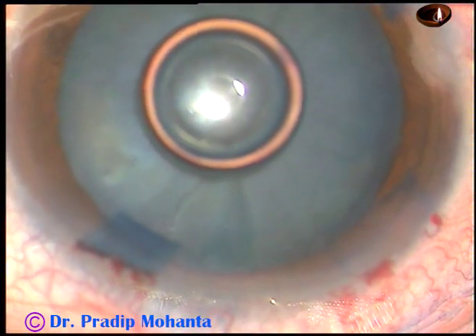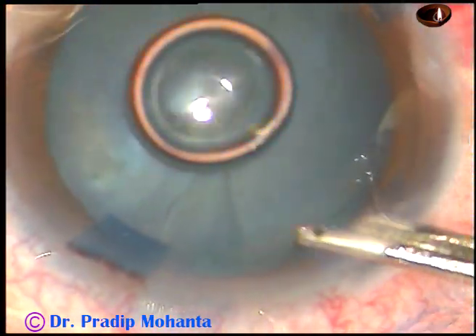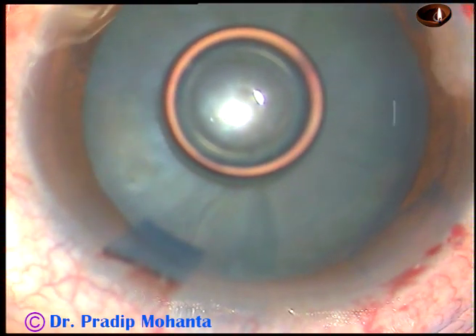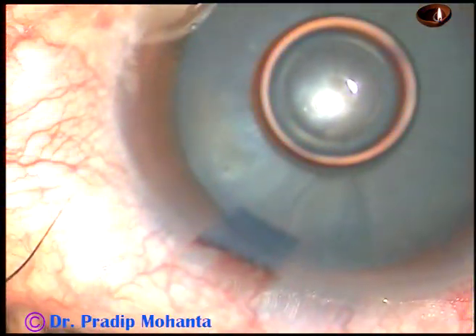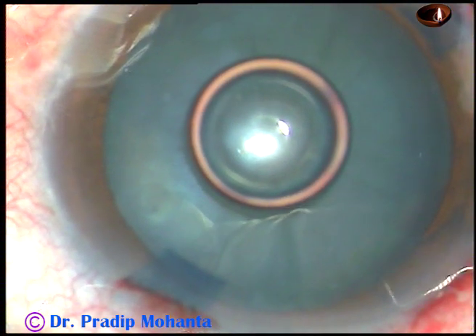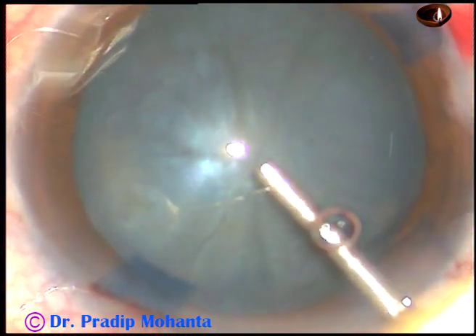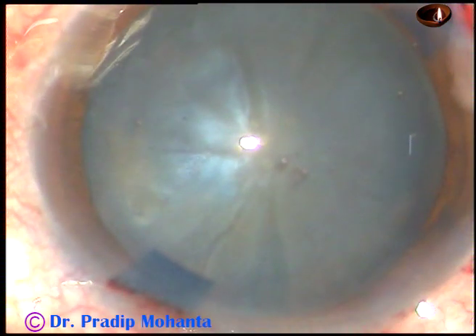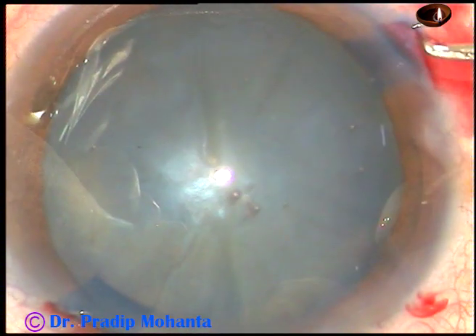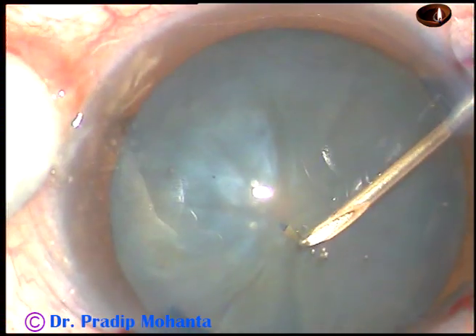Then I replace the BSS with 2 percent hydroxypropyl methyl cellulose. I do this because there are a lot of impurities in the dye that we get. The anterior chamber is filled up with 2 percent hydroxypropyl methyl cellulose and then capsulorhexis is done.